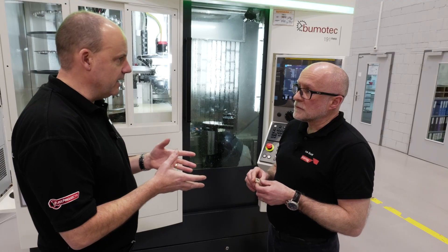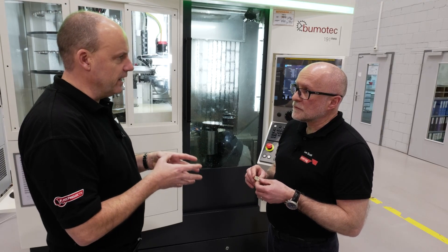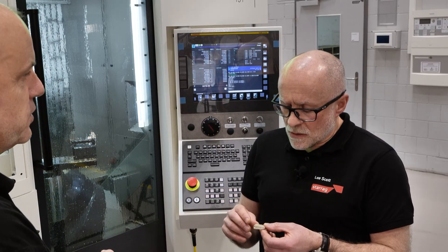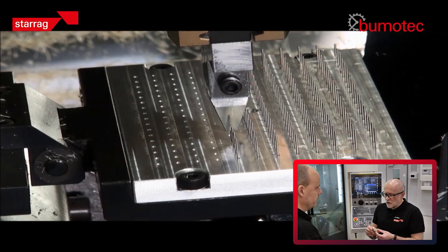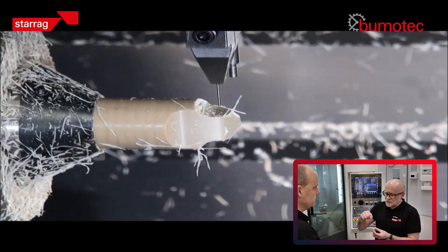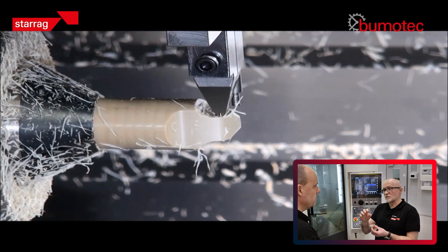One key point we haven't spoken about yet is that PEEK can't actually be detected on an x-ray. To overcome that, these products have two pins fitted so that on an x-ray those pins can be seen and the surgeons can see the orientation.